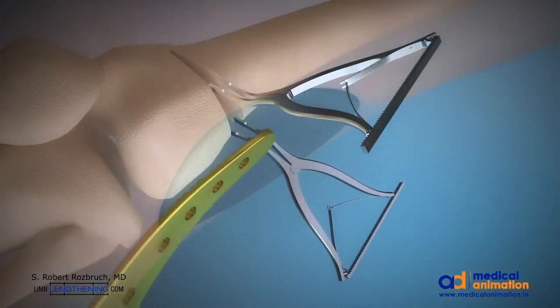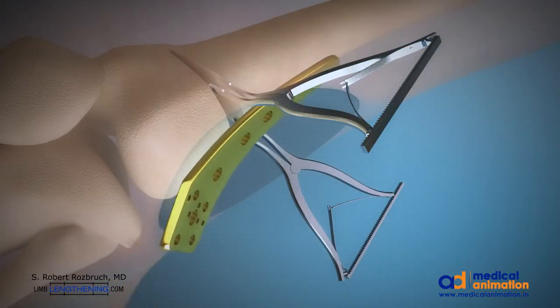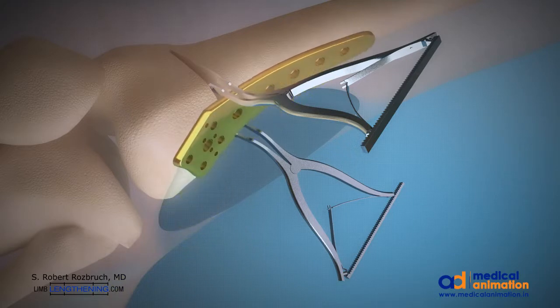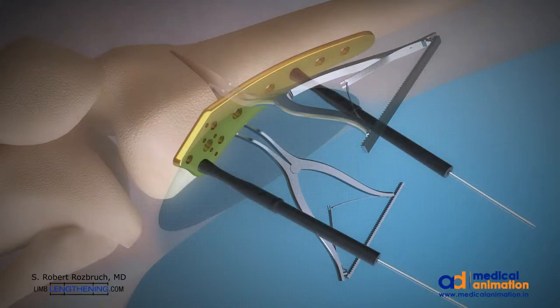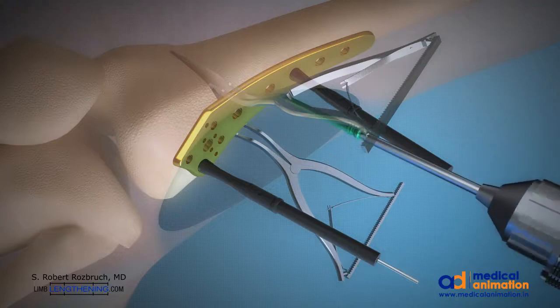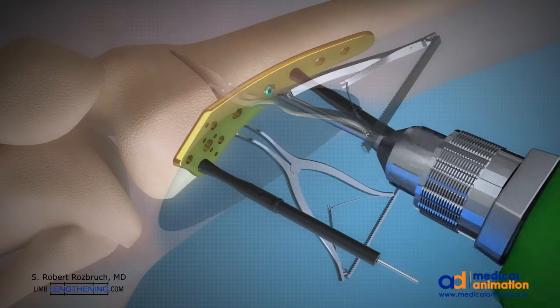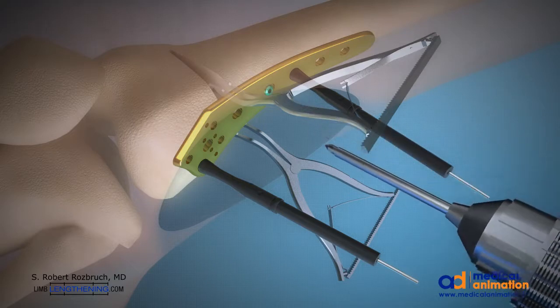The titanium plate is then inserted into the optimal location to stabilize the osteotomy and provisionally fixated. Stabilization with locked titanium screws into the plate is performed — I typically use 4 bicortical screws in the proximal segment and 5 locked screws in the distal segment. This provides excellent stability.